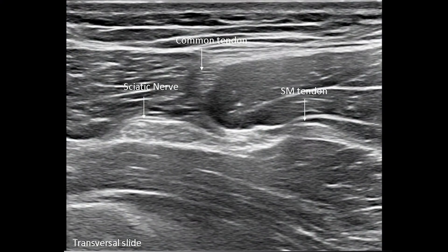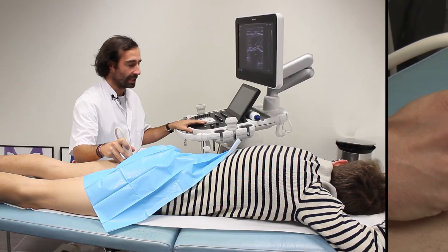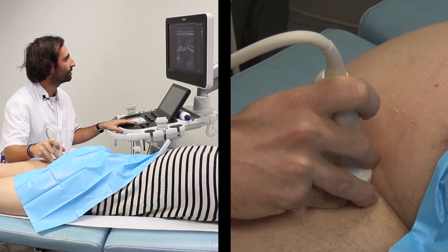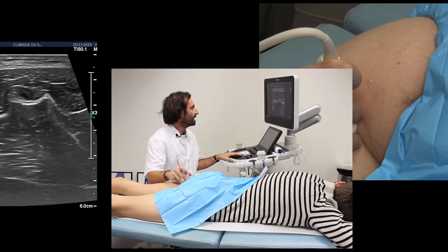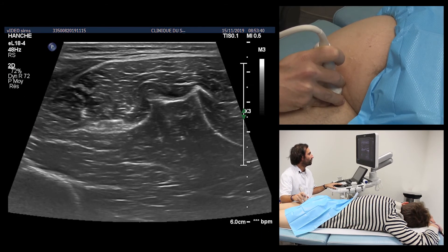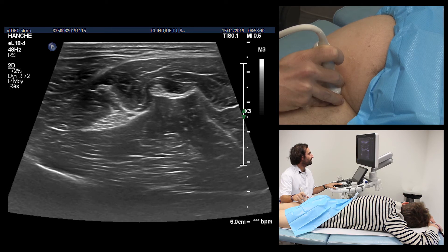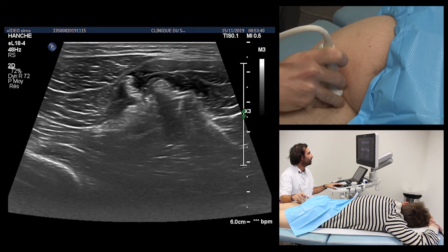The study of the posterior hip muscle groups begins with the study of the hamstring muscle group. We find at the level of the posterior hip the own tendon of the semi-membranosus located just below the semi-tendinosus muscular structure, and the joint hamstring tendon concerning the biceps femoris muscle and the semi-tendinosus muscle, as well as the sciatic nerve at the lateral face of these two tendon structures.